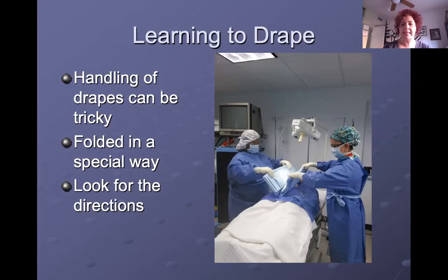So here you can see a couple ladies. My cursor is being weird. Okay, so you see these towels, these blue little towels here? When we're draping for a laparotomy, let's say, or if we're doing chest or back, it's pretty much the same if we have a flat area that we're draping. First, we're gonna do something called squaring off.